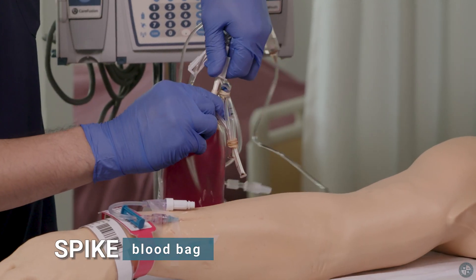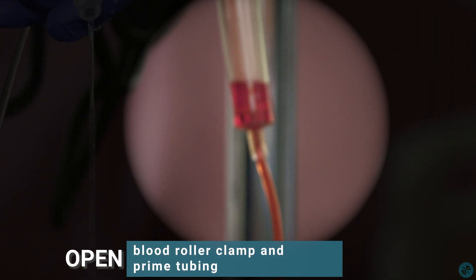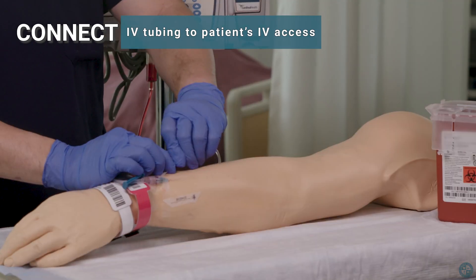Spike blood bag. Open blood roller clamp and prime tubing. Be sure to prime the entire line. Connect IV tubing to patient's IV access.